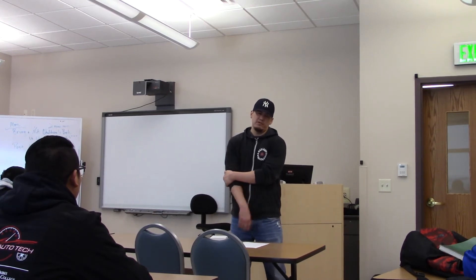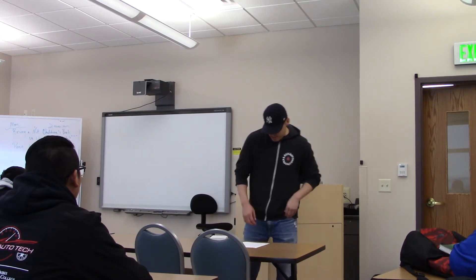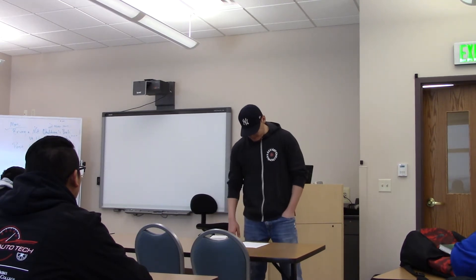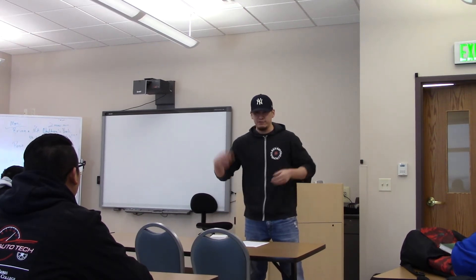I think it was before that, but I used to really do nothing about it. When you've got a hearing aid, I'll just show you guys how it works. I'm going to take it out, so if you guys got any questions, you're going to have to really speak up.